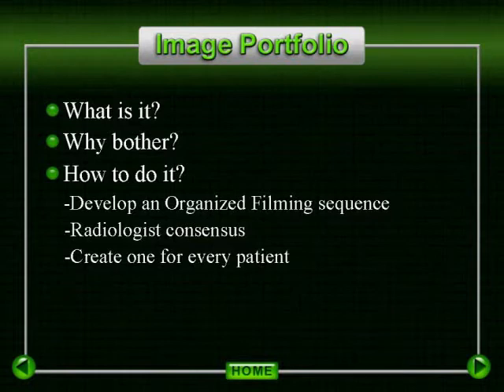Once you have created this file, however, make sure you consider 2 additional issues. First, evaluate how the significant file will be managed within your PACS system if you are utilizing PACS. After creating portfolios, it was several weeks before we realized that the saved file of significant images was placed at the very end of all of the images within the PACS file. Subsequently, when our referring physicians opened a case in their office, they would have to advance through all images to get to the significant file. This often took time that they did not have. We found that there was a way to place our portfolio of significant images as a priority at the beginning of all the series.